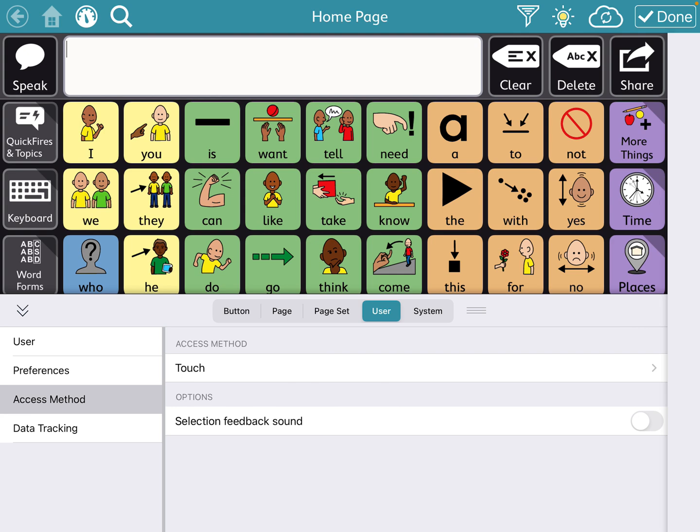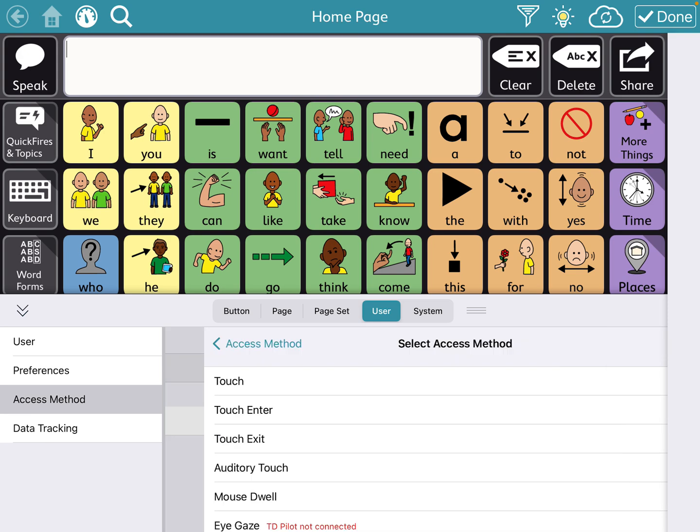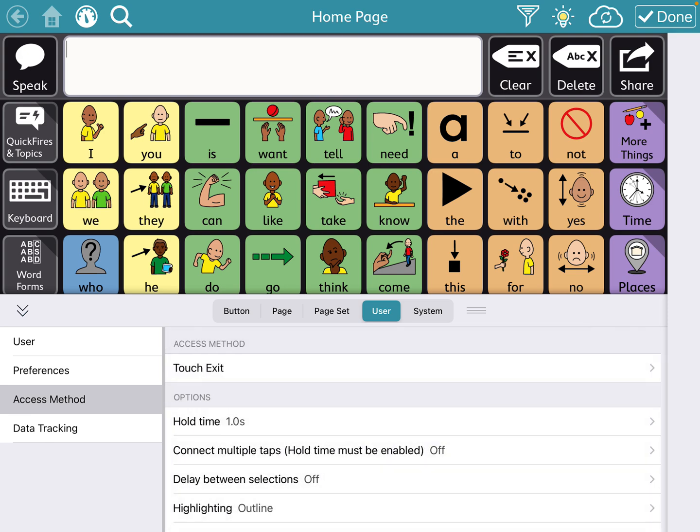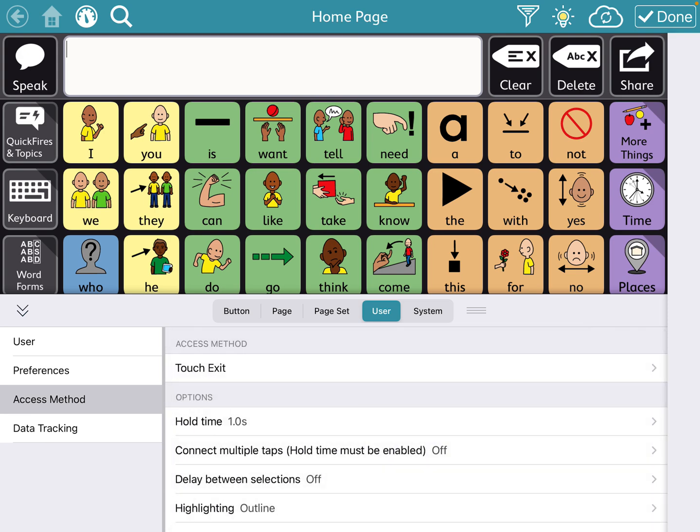And that will stop it from activating every single button that they're dragging their finger across or that their other fingers are by mistake hitting. So you want to go to access method under user and change it from touch to touch exit which will mean it will only activate when you move your hand or exit that button.